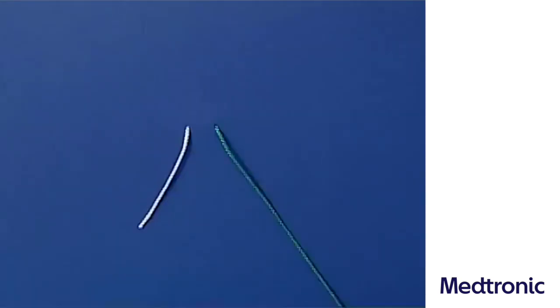The Instrument Tie. In certain situations, for example if there is only a very short suture end available, it is possible to tie the knot by using the needle holder.